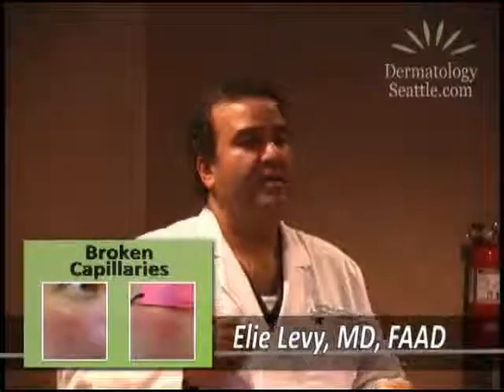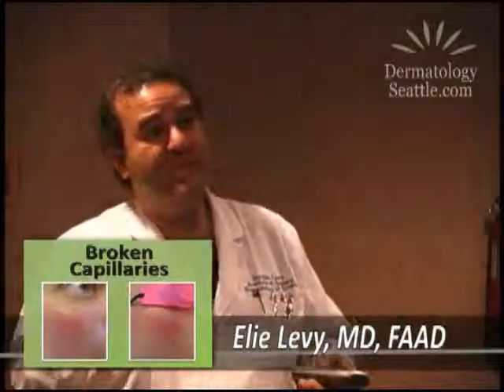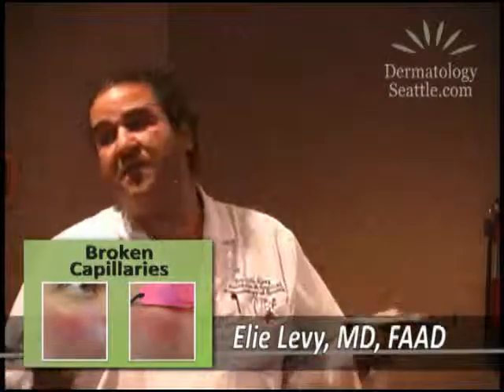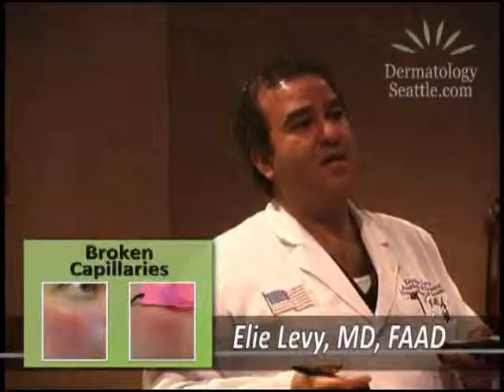How long does it take for the redness to go away? A couple days. Yeah. You can see it's more red there. It's a little bit swollen because the heat of the laser is going to dilate the follicles. Right. There's laser light energy that's gone into the skin. So.